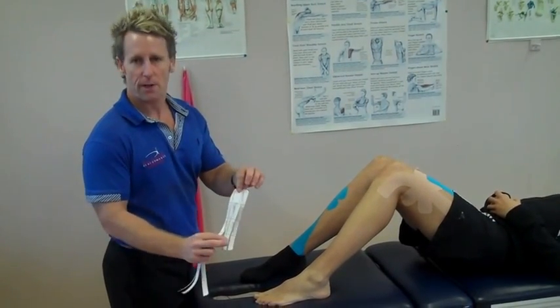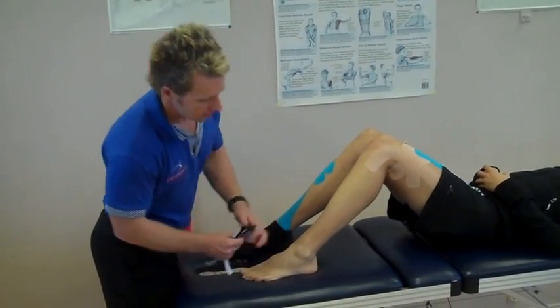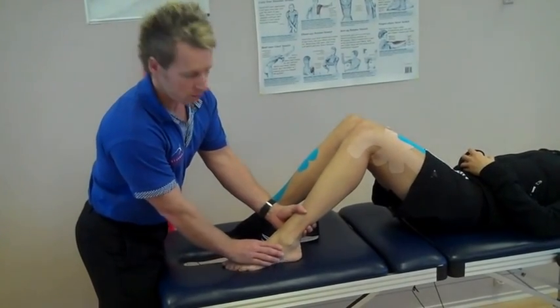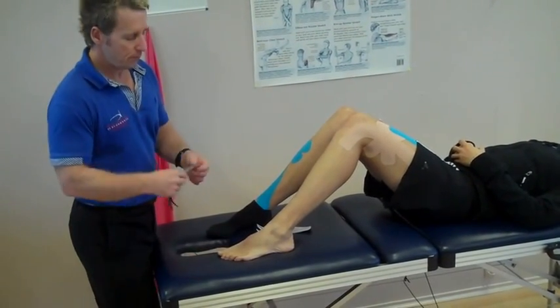I've actually cut it into four squares on the back of the tape. So in this case, Maria potentially has an ankle that's swollen, so if I naturally put it into a stretch position it's going to be uncomfortable. So we're literally going to tape in this position.